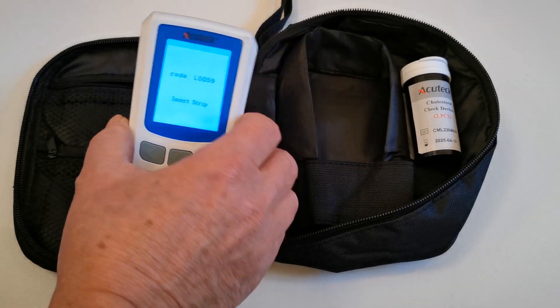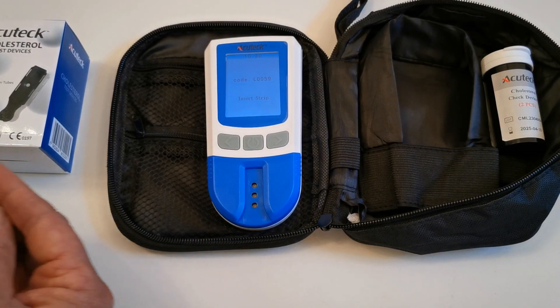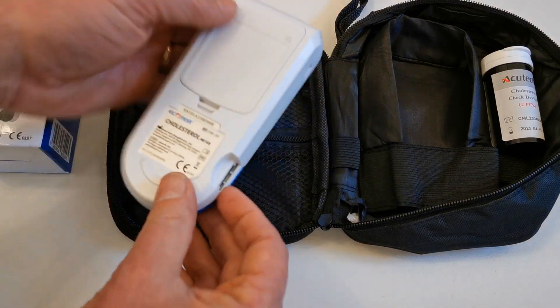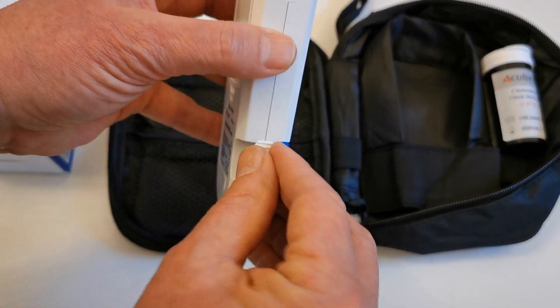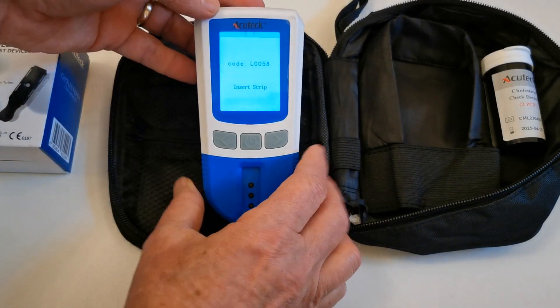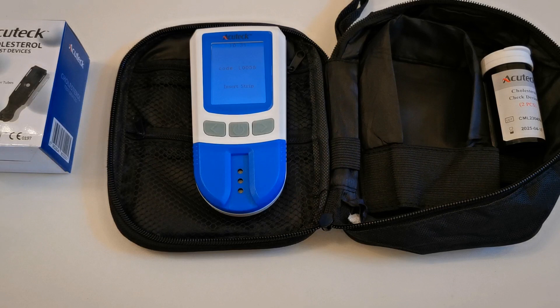When you're ready to run your first test, you will need to have your test devices to hand, which come with a code chip specific to the batch of test strips. This device is inserted into the meter on the side port. I'm going to put this code chip into the device now — it's a little tricky to get it aligned. It reads code reference L0058 for this particular code chip that comes with the test strips.